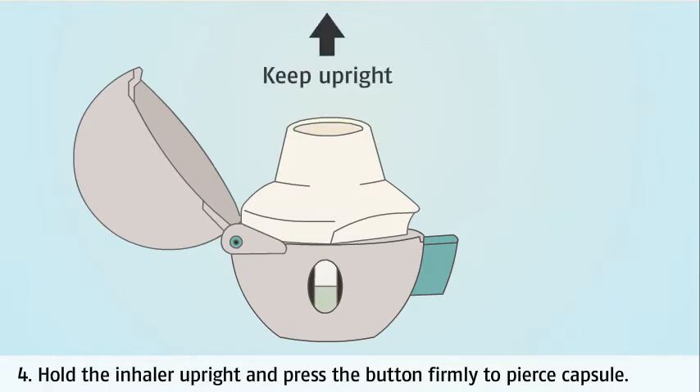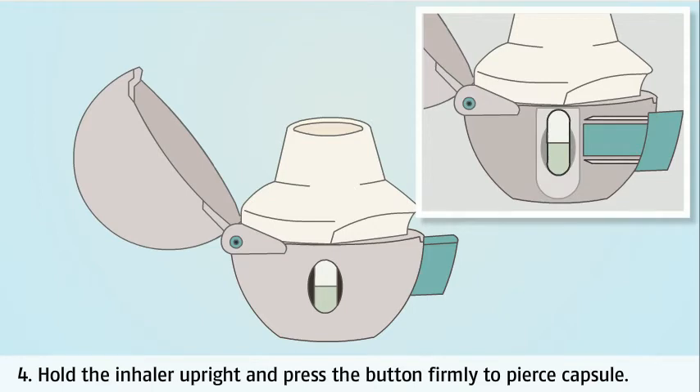Hold the inhaler upright and press the green button firmly to pierce the capsule. This button has two sharp rods that will puncture the capsule to allow the powdered medicine to be released. The capsule must only be pierced once and not multiple times.